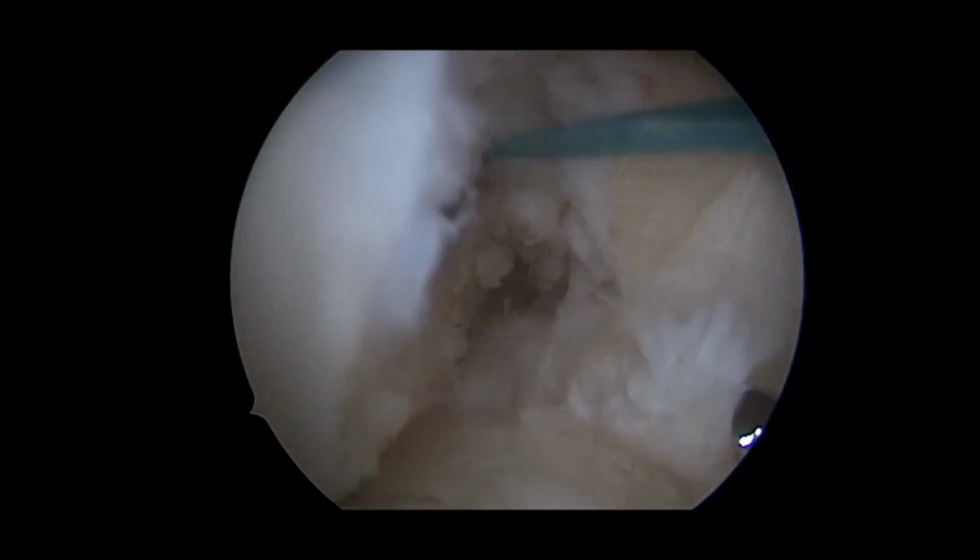Friends, our guide wire has come just posterior and medial to the anterior horn of the lateral meniscus, and it is just flush with the anterior fibers of the posterior cruciate ligament. And as you can appreciate, there is no impingement of the guide wire with the femoral notch. Checking whether there is an impingement of the guide wire with the femoral notch or not.